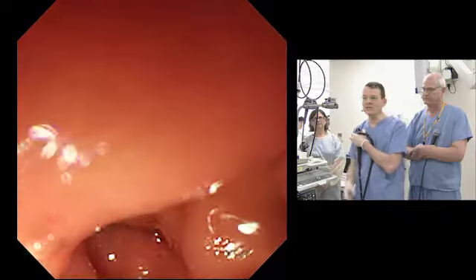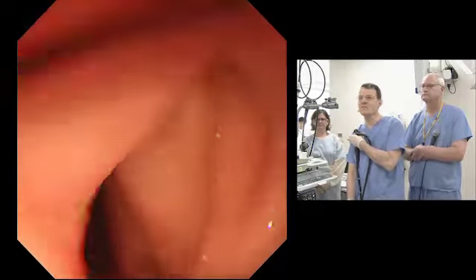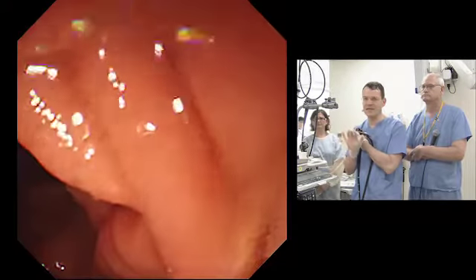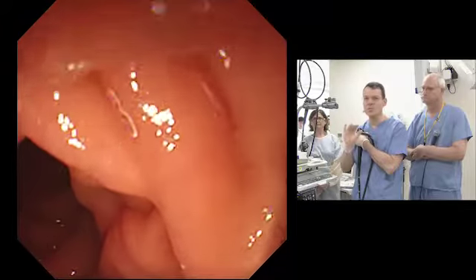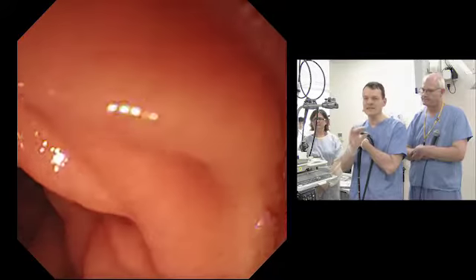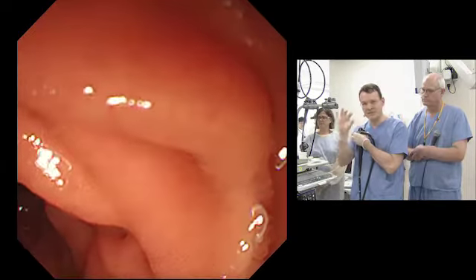When we have such an MRI image, we also have to look carefully to get more information out. You saw very nicely in this area where we didn't see any pancreatic duct, there was absolutely nothing. We had no real signs of compression, that the duct was smaller. We didn't see the duct, and after some centimeters we had the dilated duct.